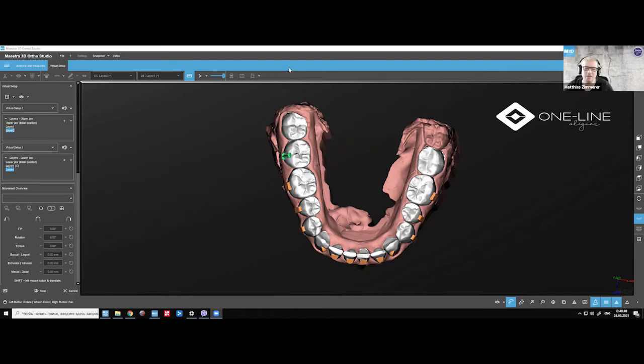Yes, okay. I think this is a good thing if printing is in the starting phase. But at the moment, I think the materials are a little bit tricky to print the aligners. But this is something that will come in the next year, I think, roundabout. We are going to print. We just got a new printer with the clear aligner. I'll just show you. We just received it last week. Yes. We are going to do it.